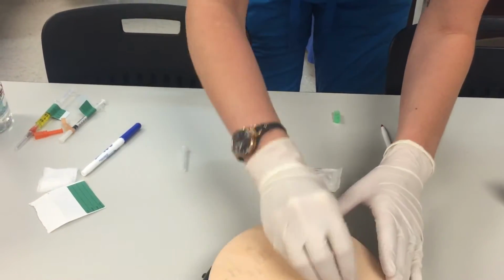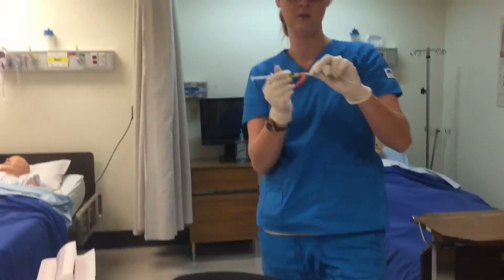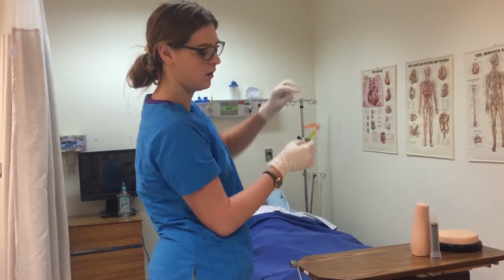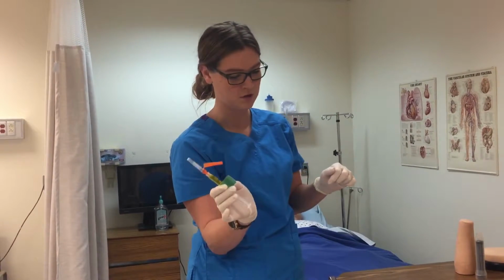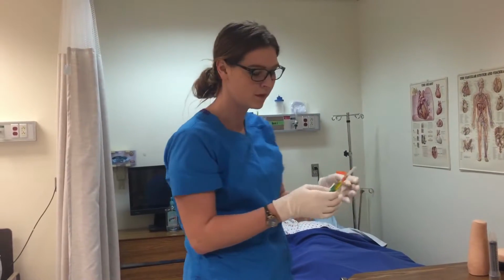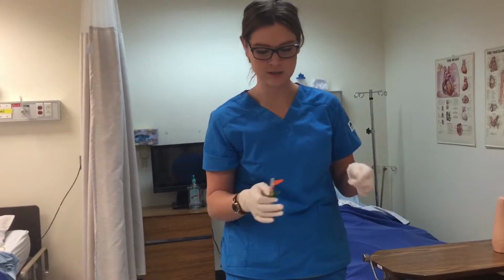If this was a real patient, it would be at a comfortable height for me. And I would turn my back away from the patient. I would go, oh shoot. Before I went into my patient's room, I checked my medication. I have performed my 3 checks. I've checked it in the med room, I checked it before I went to her room and in her room. And I've gone through the 6 rights. So I've done 3 checks and 6 rights.